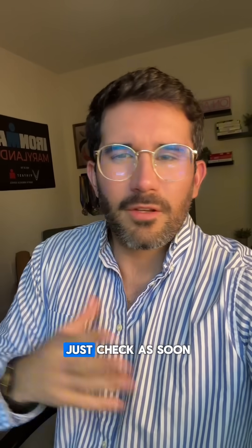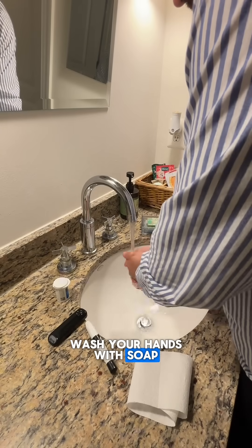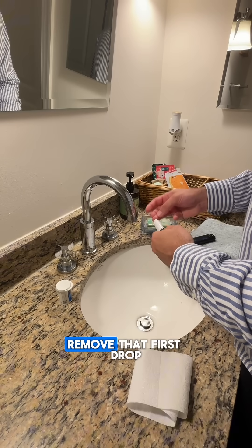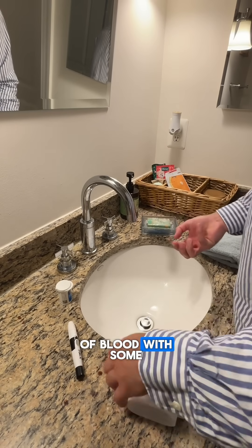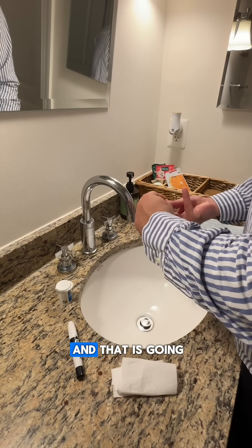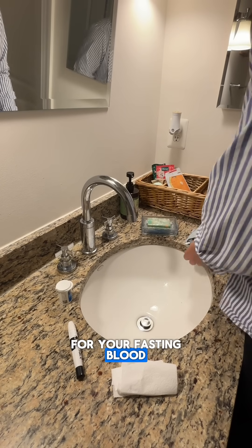So go ahead and just check as soon as you wake up. Go to the bathroom, wash your hands with soap, clean your hands, prick your finger, remove that first drop of blood with some toilet paper, and then squeeze again. And that is going to be the sample that you use for your fasting blood sugar levels.